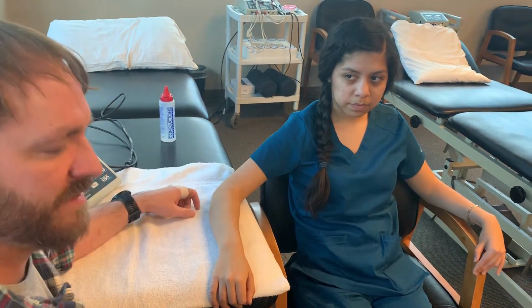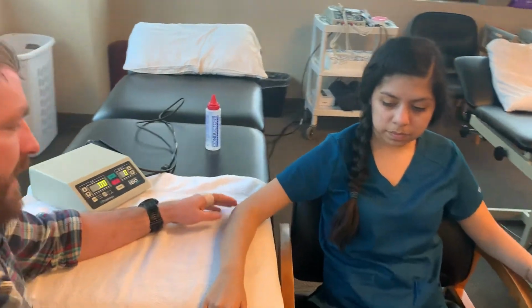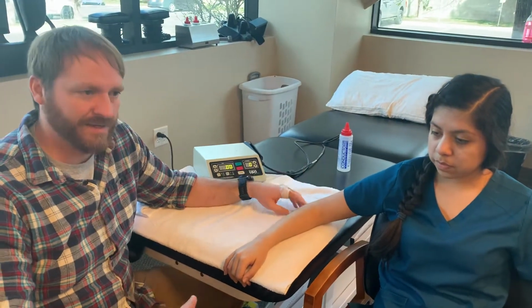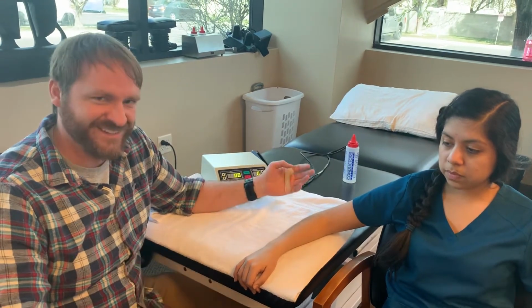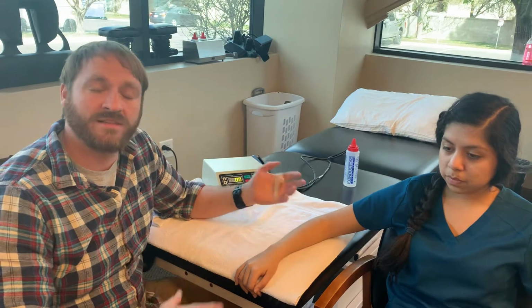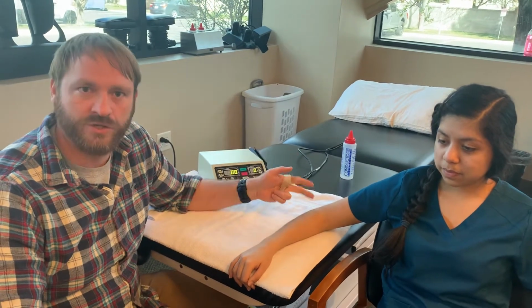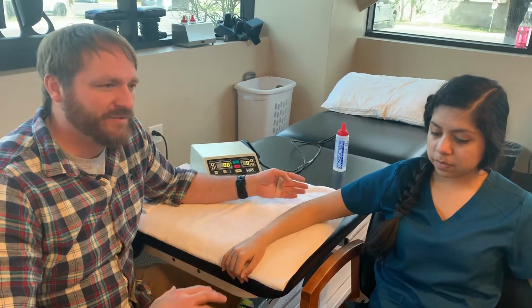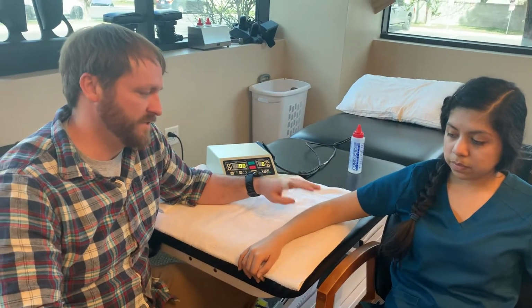And by smaller body part, I mean something that is relatively superficial. So we're going to go with the lateral epicondyle here today. Let's say the patient had some lateral epicondylitis. We wanted to heat up the tendon, and as we will discuss in lecture, ultrasound is a lot more effective in heating deeper, more dense tissue. So things like tendons and then scar tissue, anything with a relatively high collagen base to it. So it's going to be slightly effective in heating up muscle tissue, but not great, and also not great at all in heating up subcutaneous or fatty tissue.